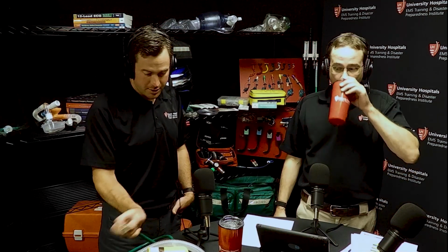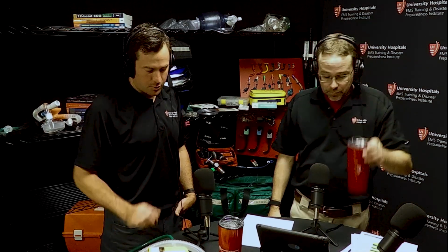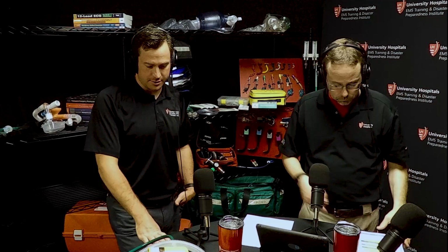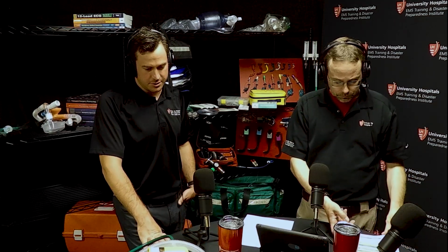So yeah, back to CO poisonings, 100% FiO2. Your CO poison patient, I just turned that till it stopped, for the benefit of your patient. This is a great way to wash out the CO and push it off there and get oxygen where it needs to go again.